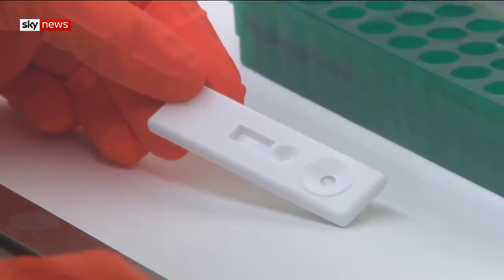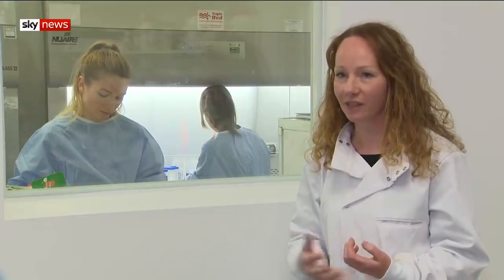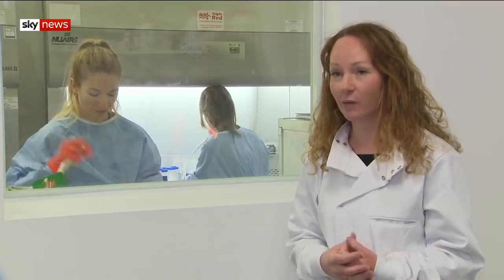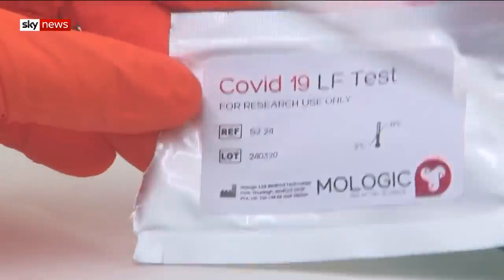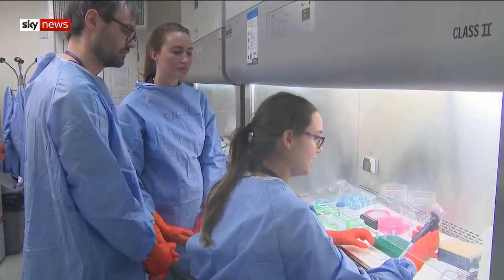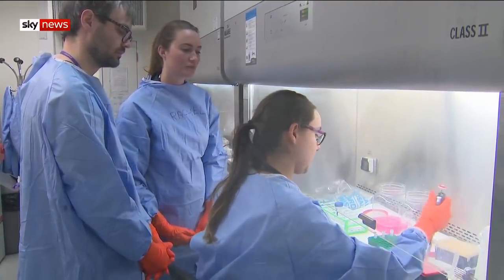If we're telling people that they've been infected and they've recovered, but in fact they're still vulnerable, they still don't have any immunity to the disease, then that's going to be disastrous, especially if those people are frontline healthcare workers, for example. So the process is very simple and very fast. It takes just 10 minutes and it only needs a finger prick of blood.